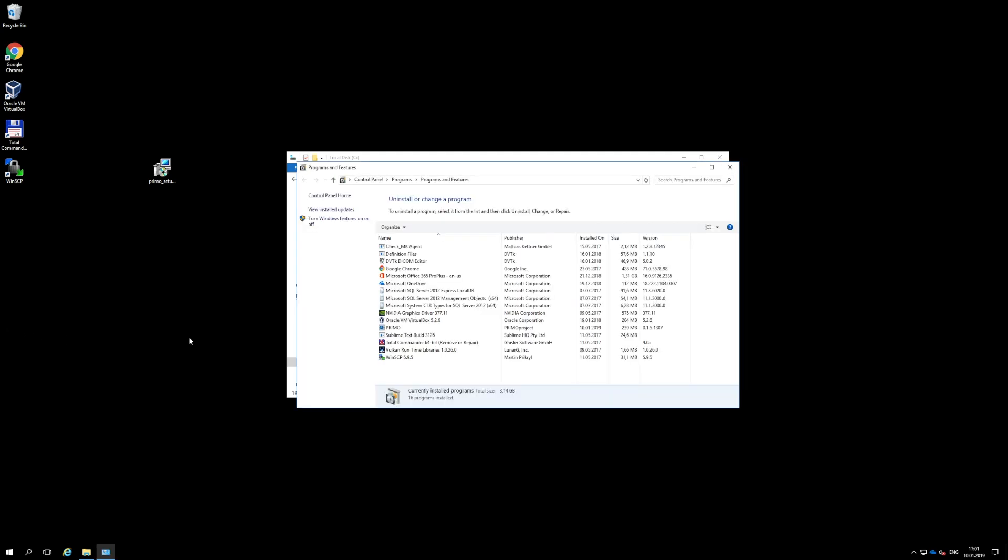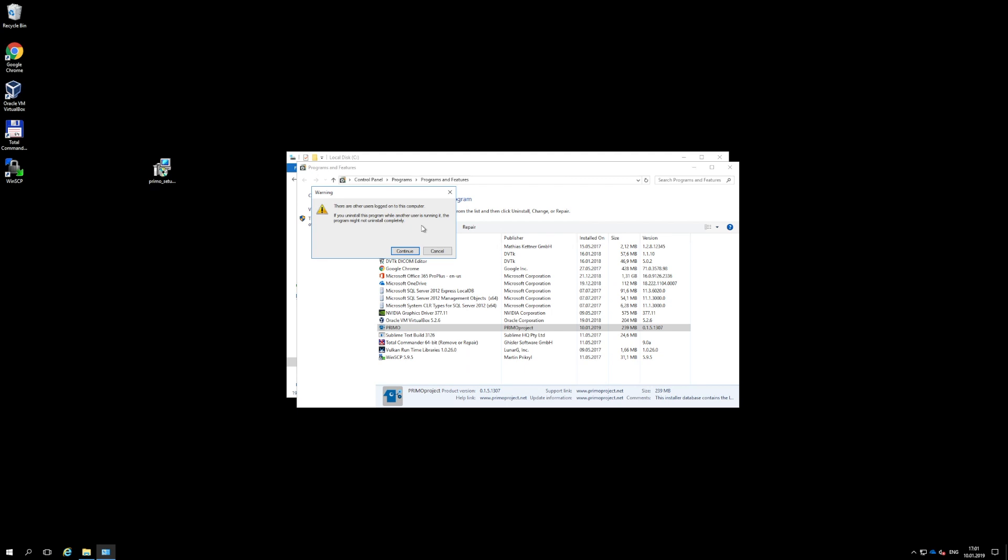No two versions of Primo can be simultaneously installed in the same computer, even if they are installed in different directories.